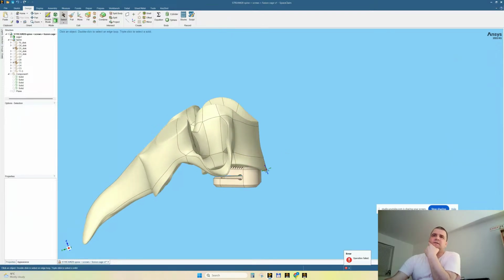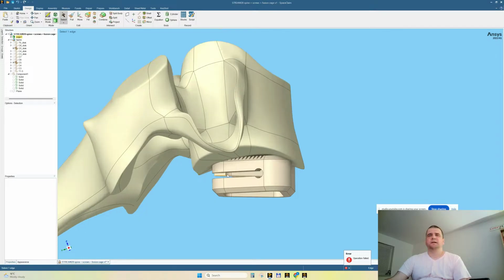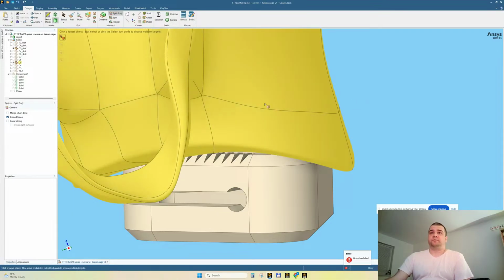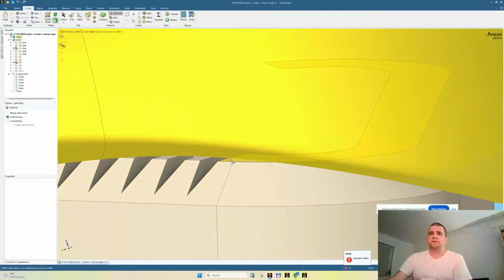So if I cut here, we will have other parts remaining. Let's do it, because I would like you to see the command. Let's save before doing something destructive. Split body. It says a target object. This is the target, and it asks for a plane, face or plane, whatever. I will ask for this face.